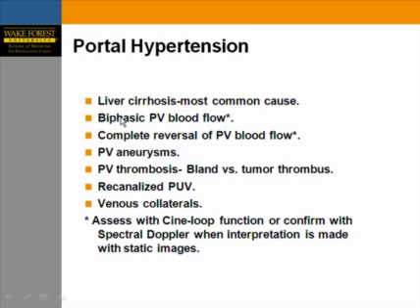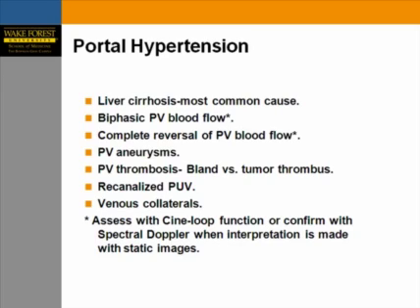When evaluating portal hypertension, look at the pattern of blood flow in the portal vein — check if it's biphasic or reversed. Check for portal venous aneurysms and thrombosis. Distinguish bland thrombus from tumor thrombus. Look for signs of portal hypertension like re-canalized periumbilical vein and venous collaterals. Confirm findings using a cine loop function or spectral Doppler rather than static images alone.